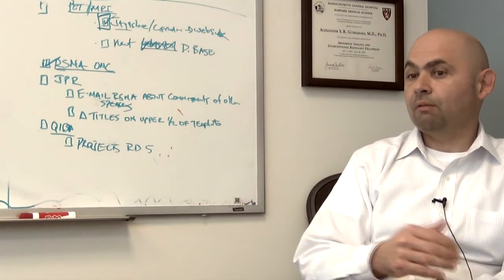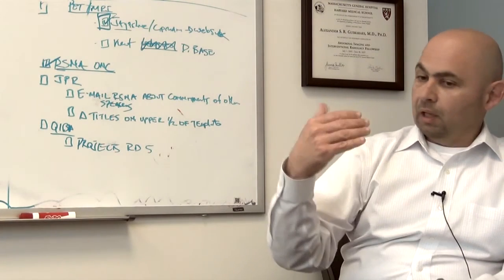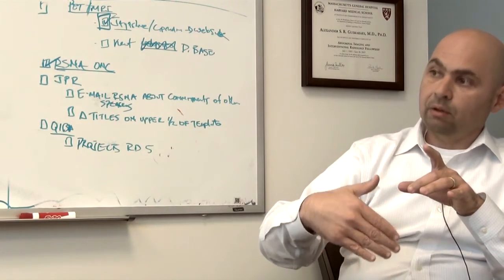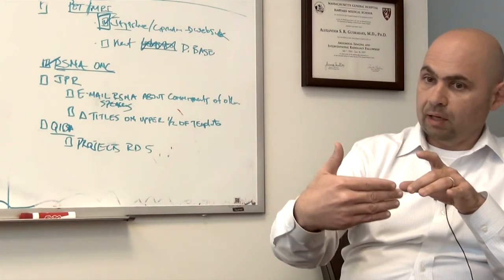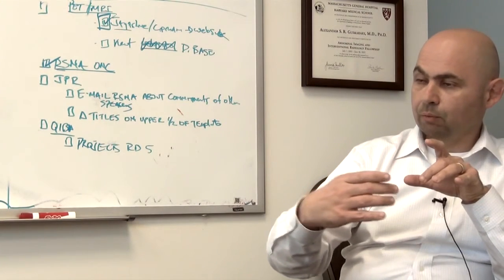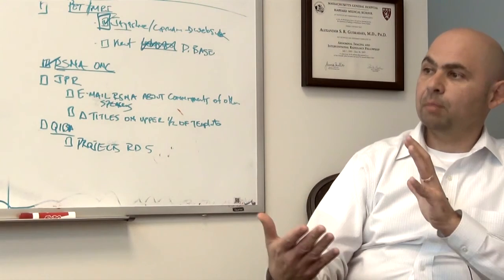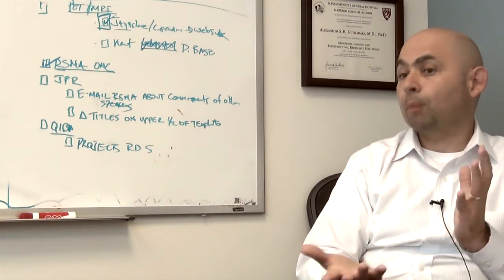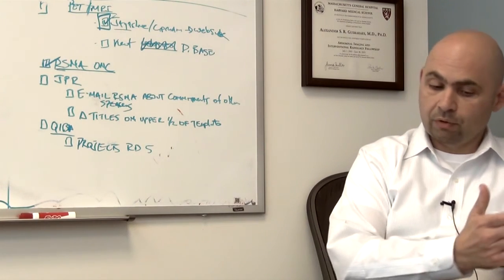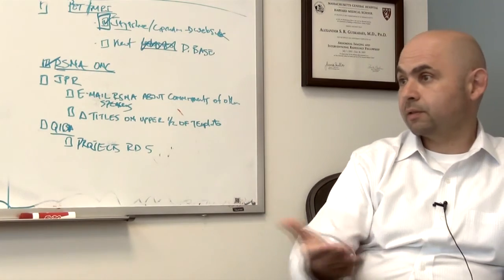You can actually then devise these pulse sequences which allow you to select a certain slice of spins, right? Only excite those spins. Excite means that I only transmit the energy to these spins in this frequency bandwidth, and then I can encode the information spatially in the other dimensions by properties of the Fourier transform, which allows you to convert frequency information into time or space in this case.